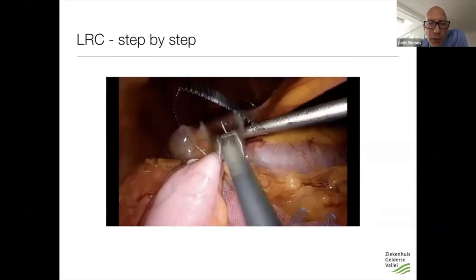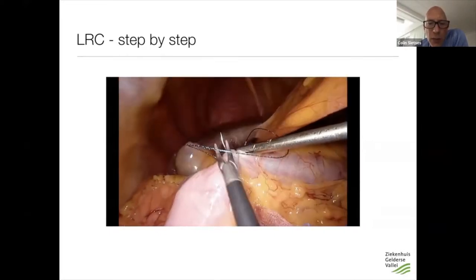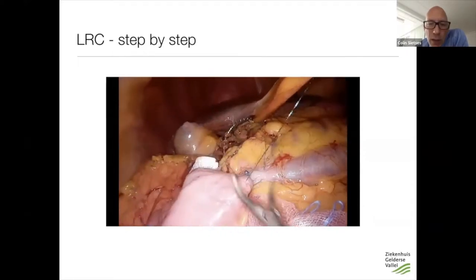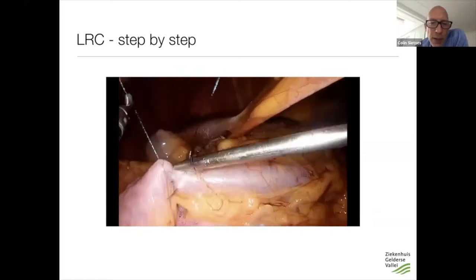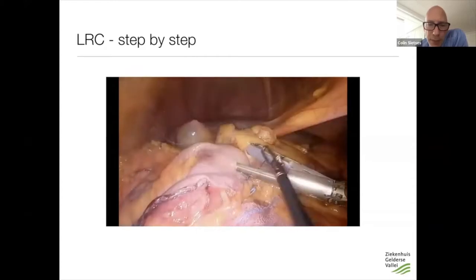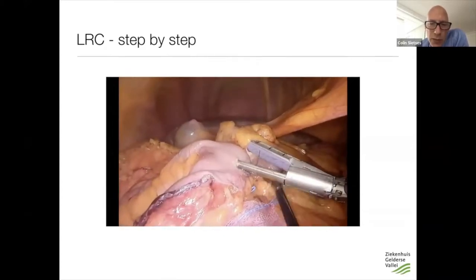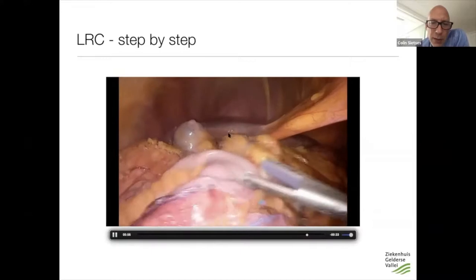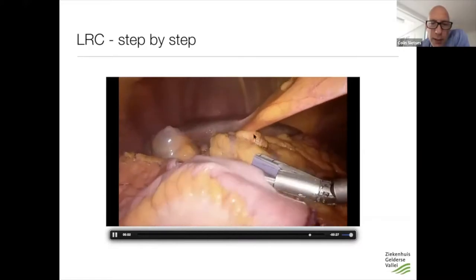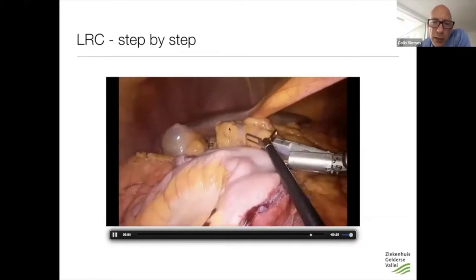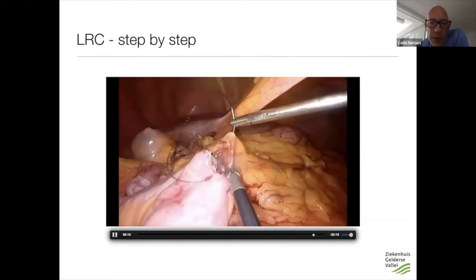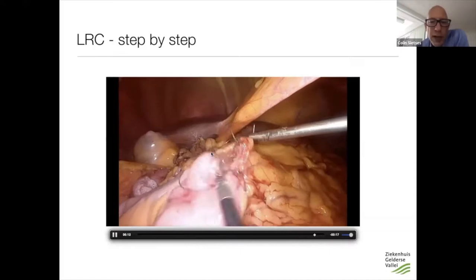Andreas will also show different anastomotic techniques. In this case the small bowel kept slipping, so I first did a suture with a V-lock to keep the small bowel and transverse colon in place, then made a stapled intracorporeal anastomosis. Make sure the length of the colon is large enough — you can see I made a small mistake here, it was a little too short. Preferably you have a little more room. The defect is then closed with a V-lock.